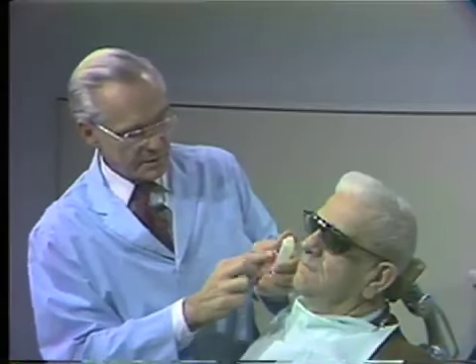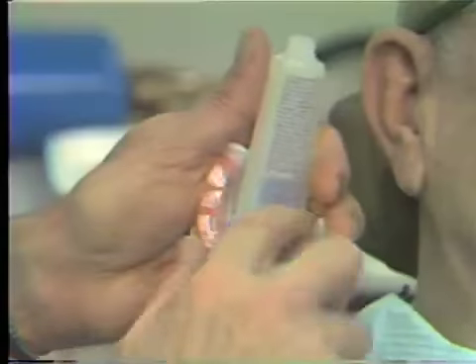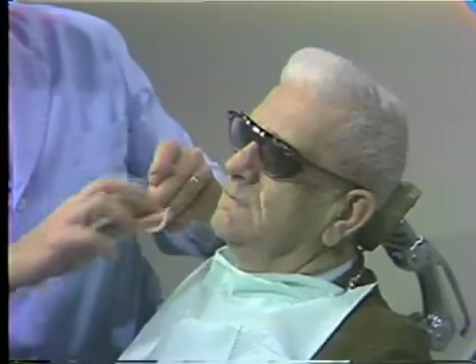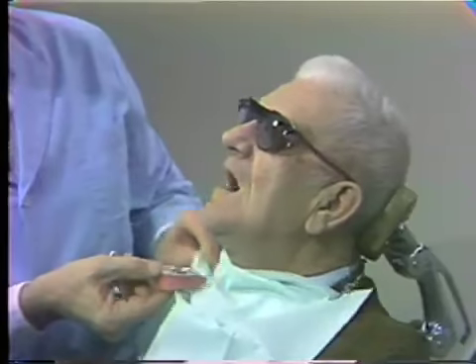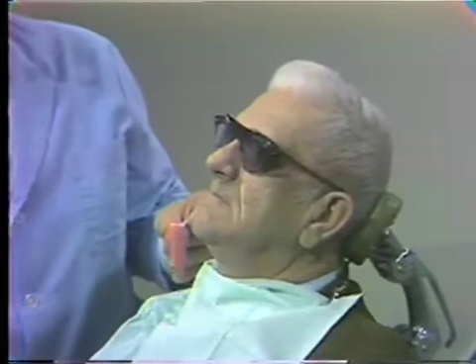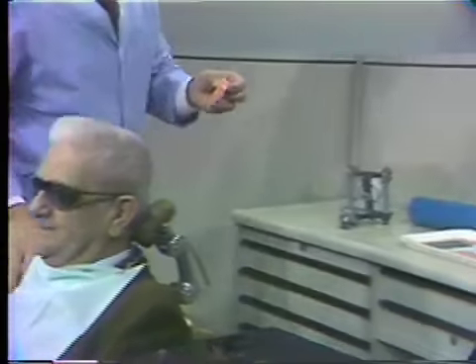Just a little Vaseline wiped over the occlusion rim and wiped into the grooves allows good separation. We now will remove the maxillary rim, and we'll go back to our Bunsen burner and soften some soft bite wax.